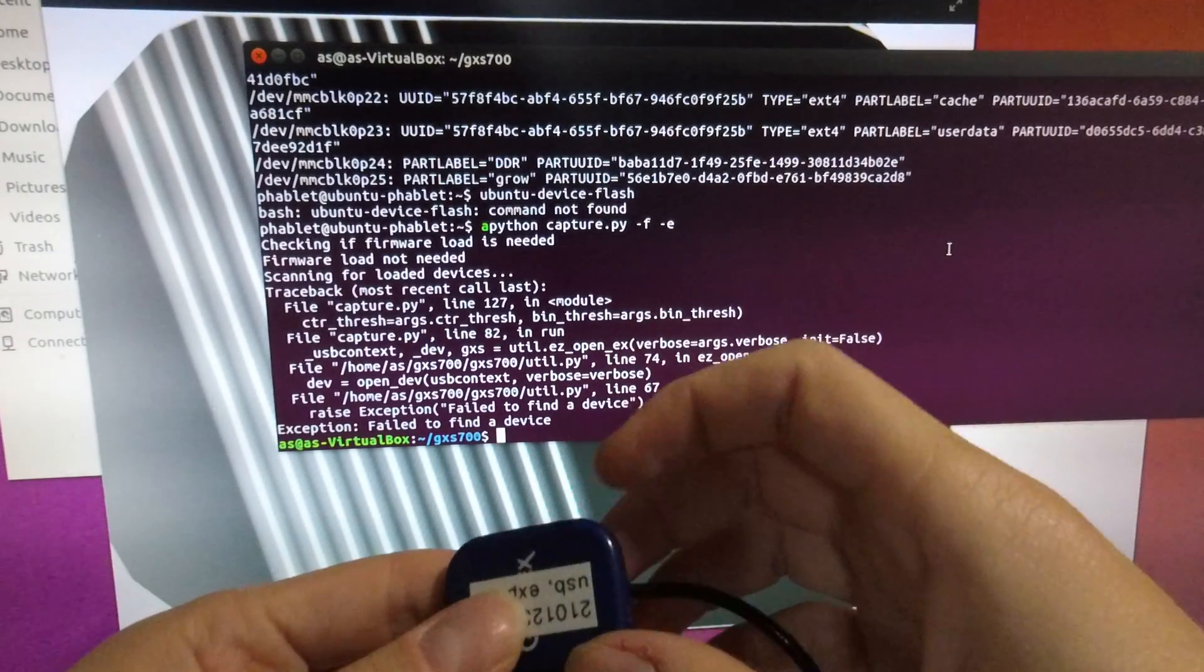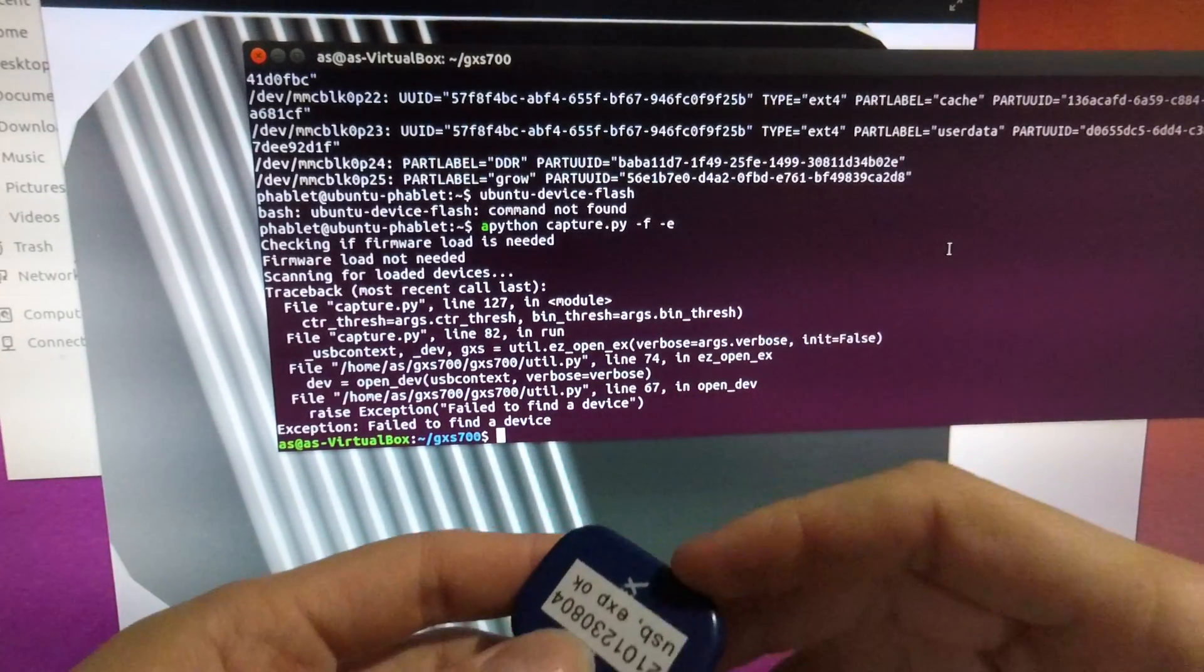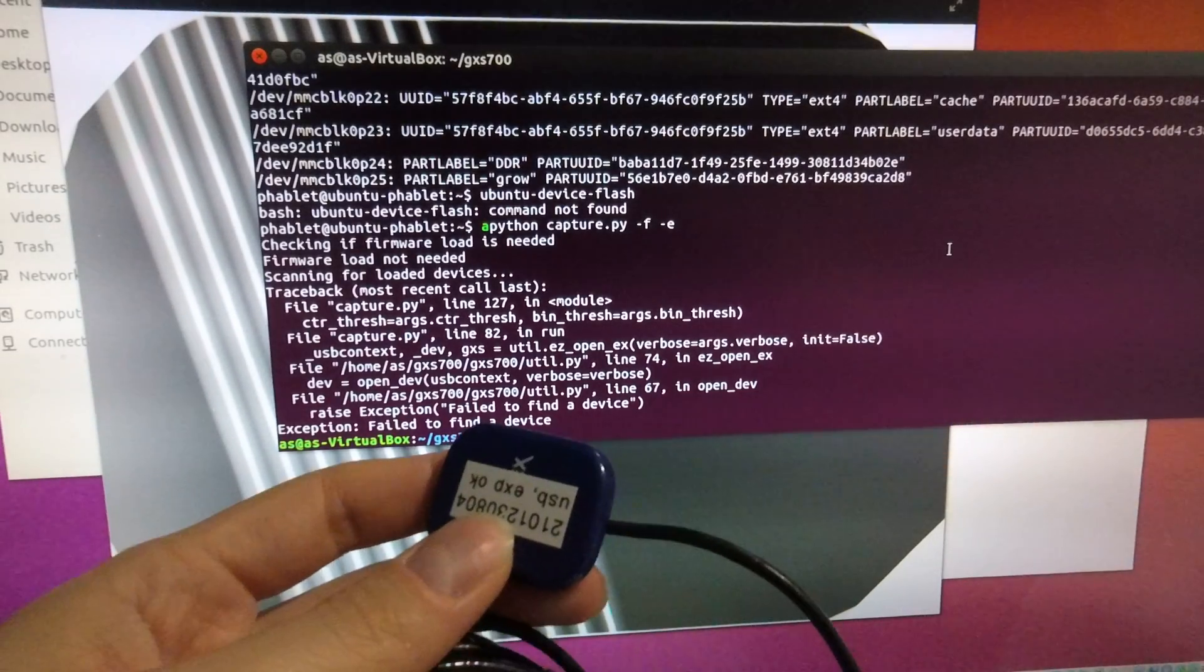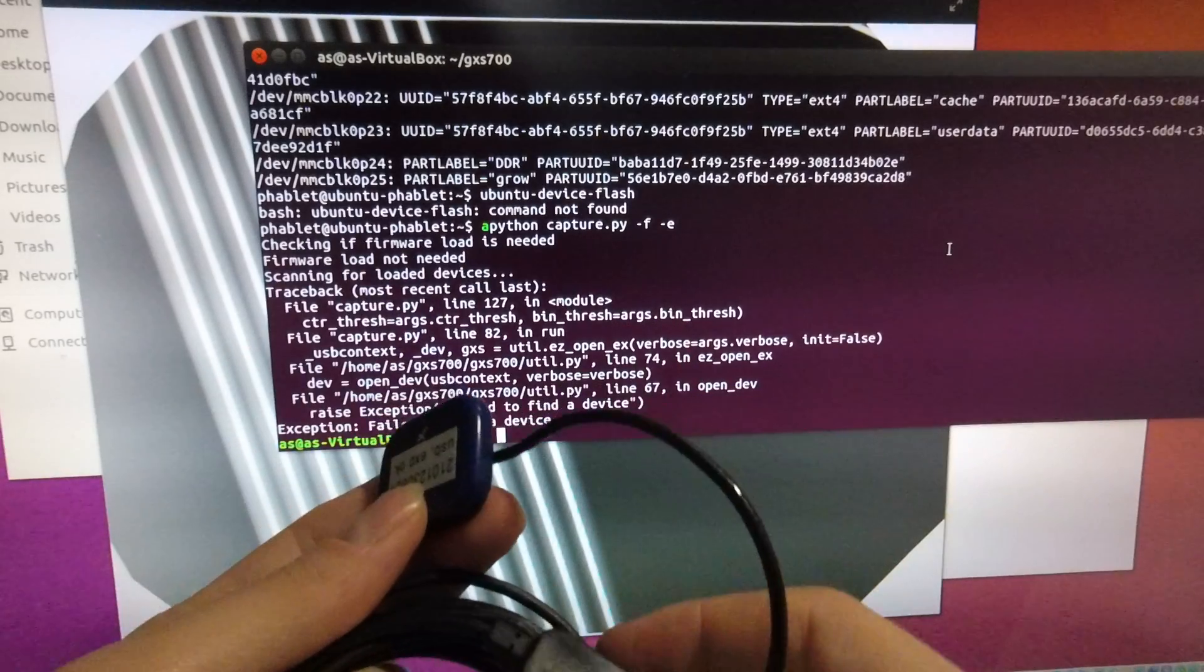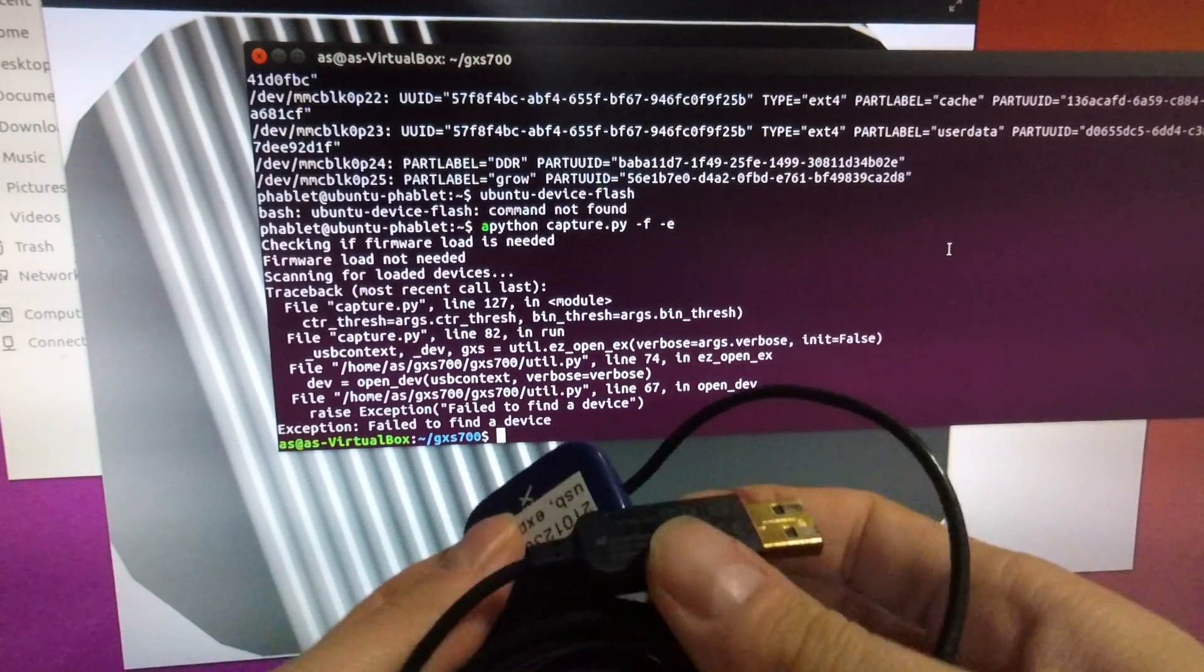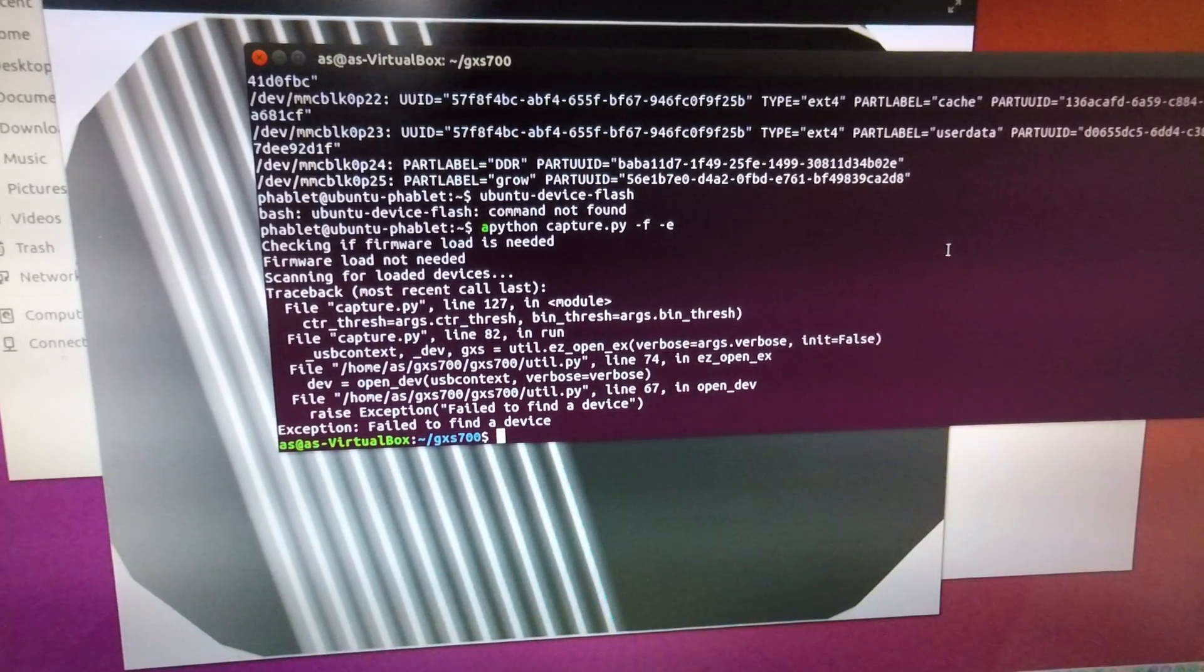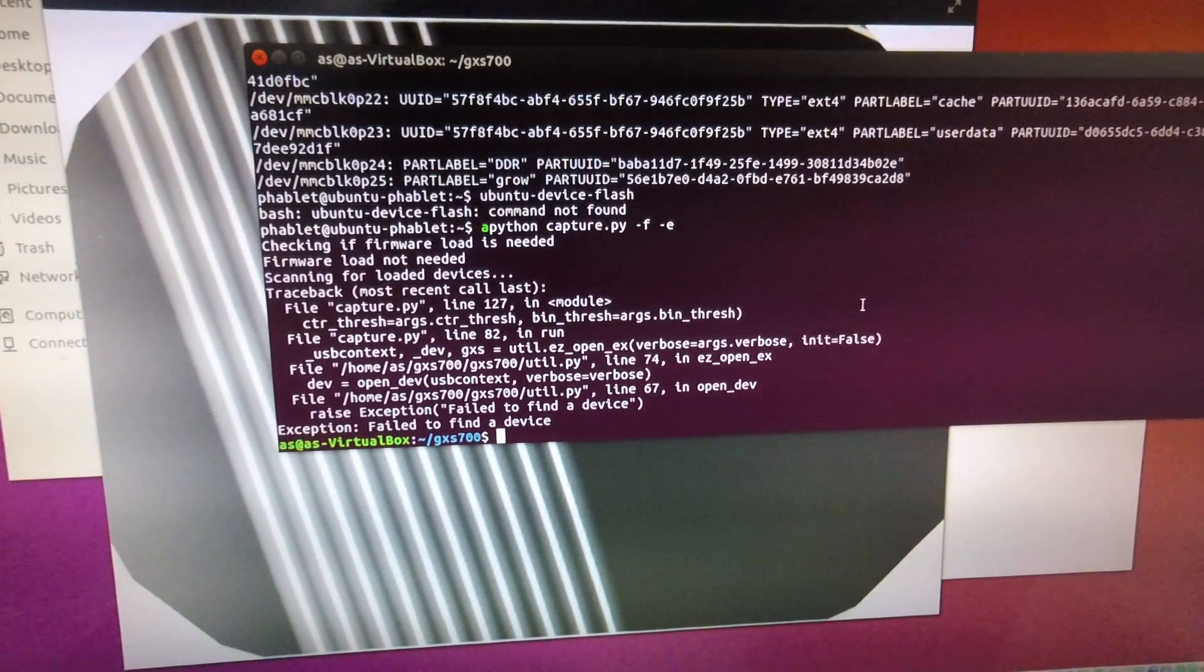When you buy the Gendex sensors new from the factory they'll come with a set of calibration files which have to be installed. When you buy a sensor used on eBay those calibration files do not exist. So let's plug this into the USB port and see what happens.